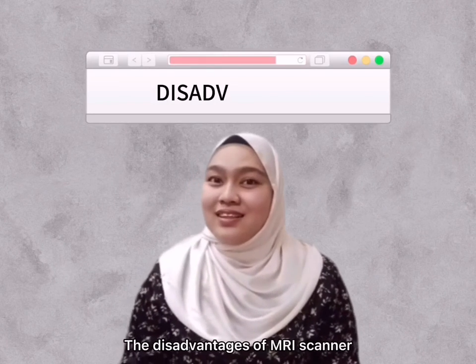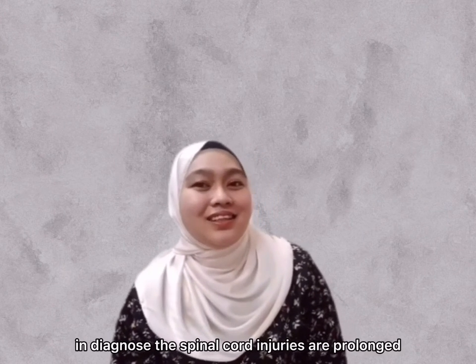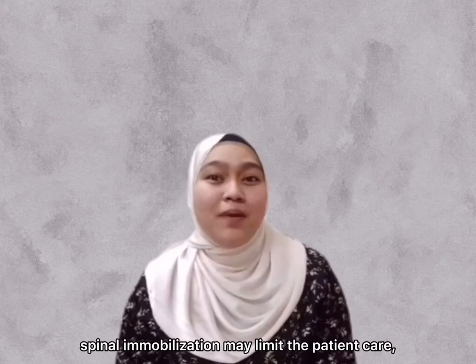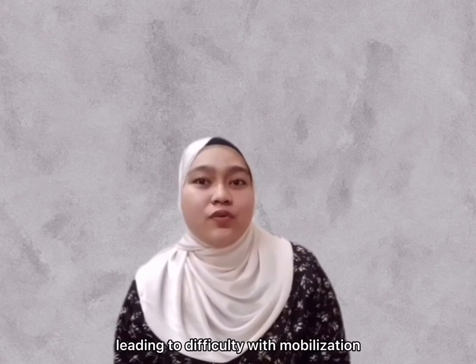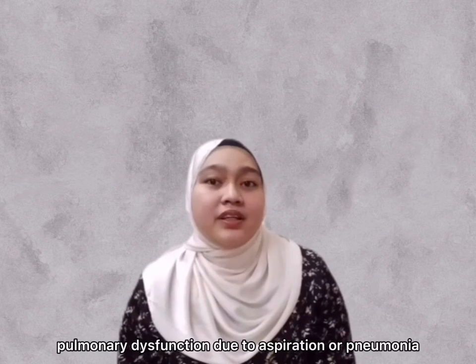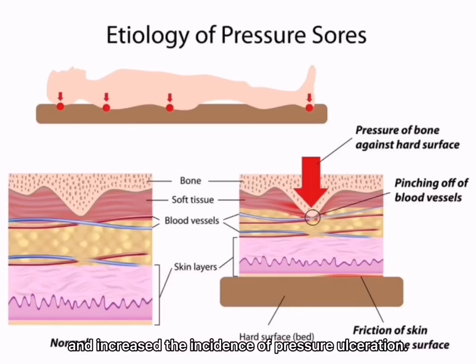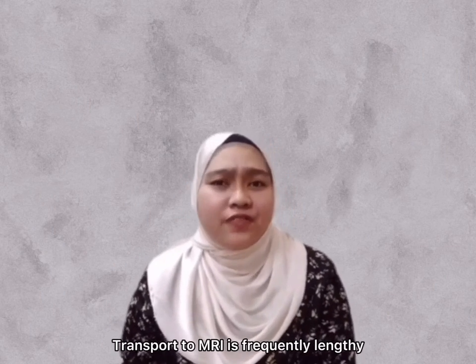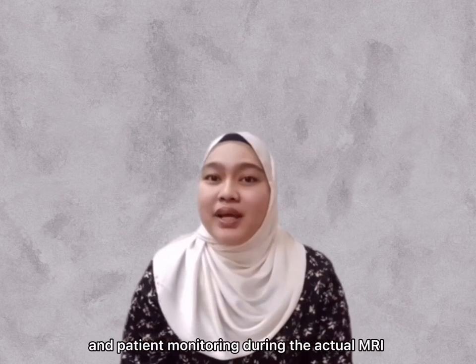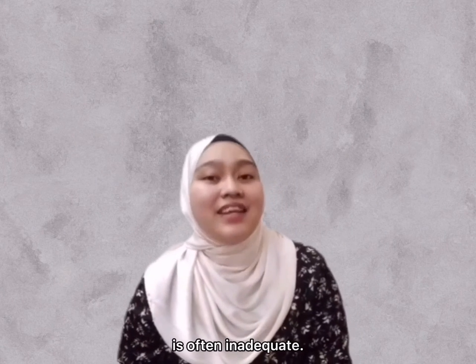The disadvantages of the MRI scanner in diagnosing spinal cord injury are that prolonged spinal immobilization may limit patient care, leading to difficulty with mobilization, pulmonary dysfunction due to aspiration or pneumonia, and an increased incidence of pressure ulceration. Transport to MRI is frequently lengthy, and patient monitoring during the actual MRI is often inadequate.